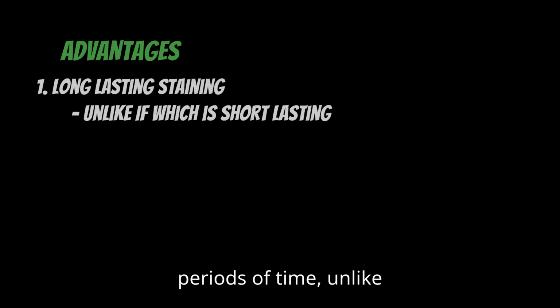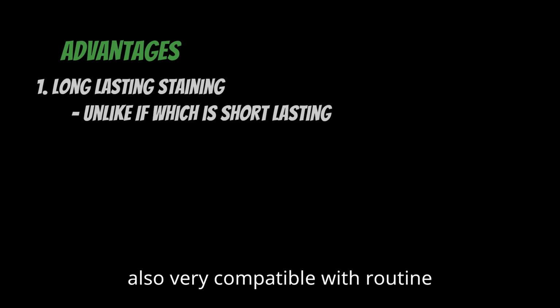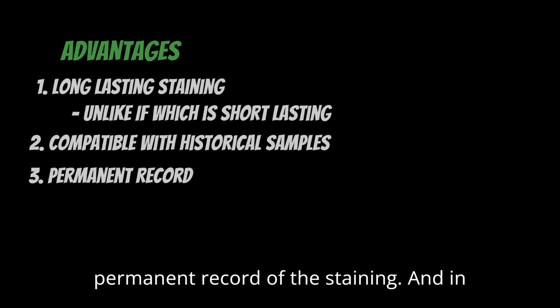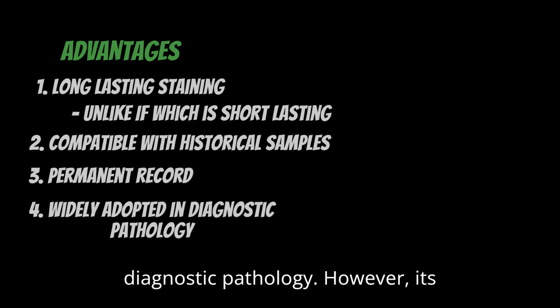Its advantages include the fact that it provides long-lasting staining. It can be viewed over long periods of time, unlike immunofluorescence-treated specimens, which are generally short-lasting. It is also very compatible with routine historical samples. It also provides a permanent record of the staining, and in general, it is widely adopted in diagnostic pathology.